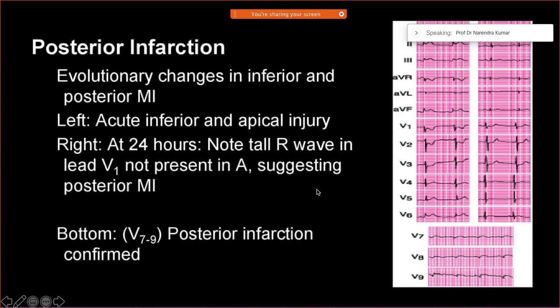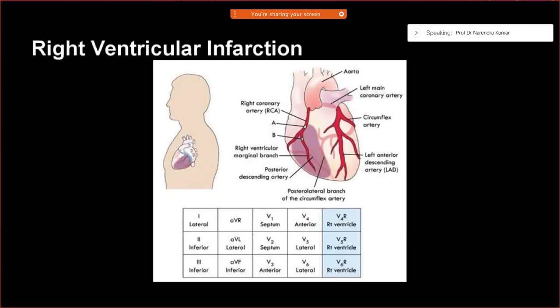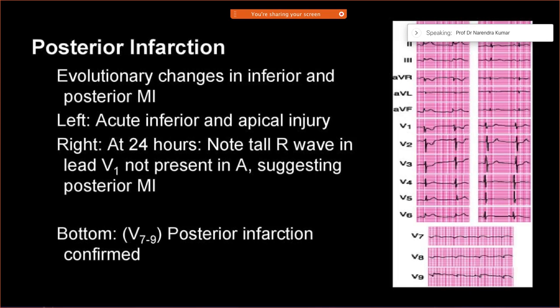As we already showed you where to put them, you can put them over there and you will be able to notice it. I already spoke about the localization.